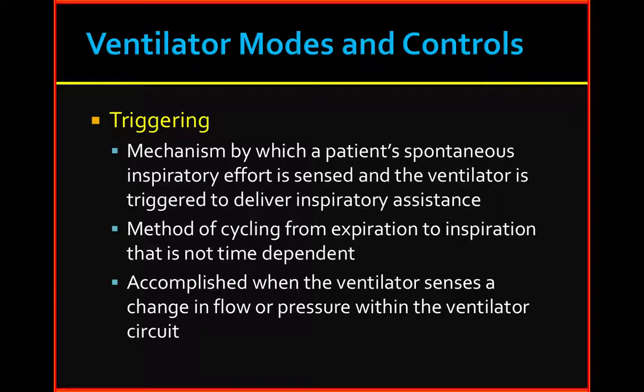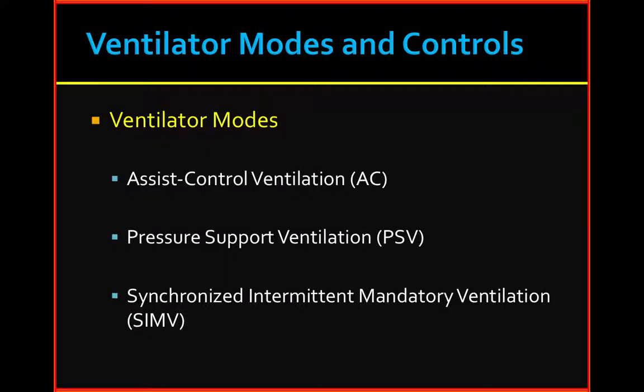And the 3 ventilator modes are these. You all understand assist control now, you saw it. You all understand SIMV, you saw that when they take a little extra breath, it's kind of a weaning mode, I think of it there. The one we didn't really talk about was pressure support, and that's in there also. That's a pressure-based system. It's not a volume, it's pressure-based. And I've given you a little bit more about each of these 3.